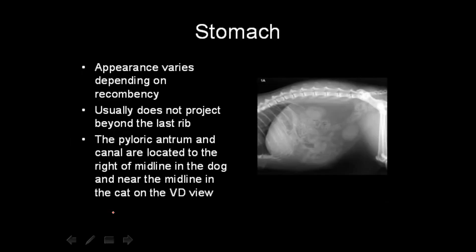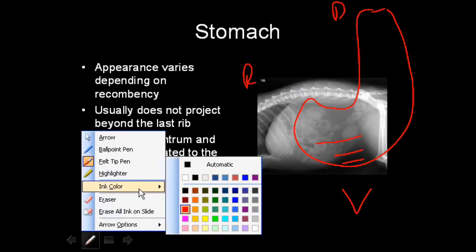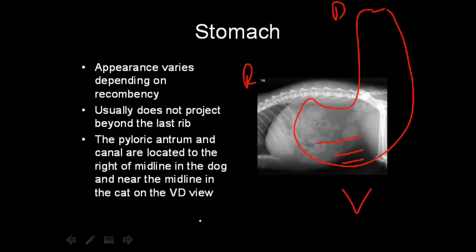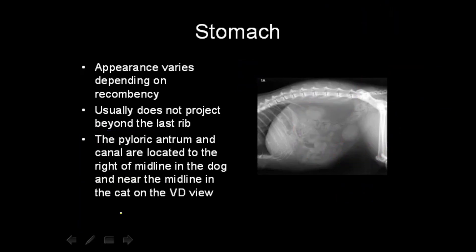The stomach's appearance varies according to the patient's position. The stomach is shaped like a J — with the fundus on the left and the pylorus on the right — and air always goes up. So if the animal is on its back, air will go to the pylorus. If on the right side, air goes to the fundus and body. If on the ventral aspect, air goes dorsally to the fundus. If on the left, air goes to the pylorus. How much air is visible depends on the position.